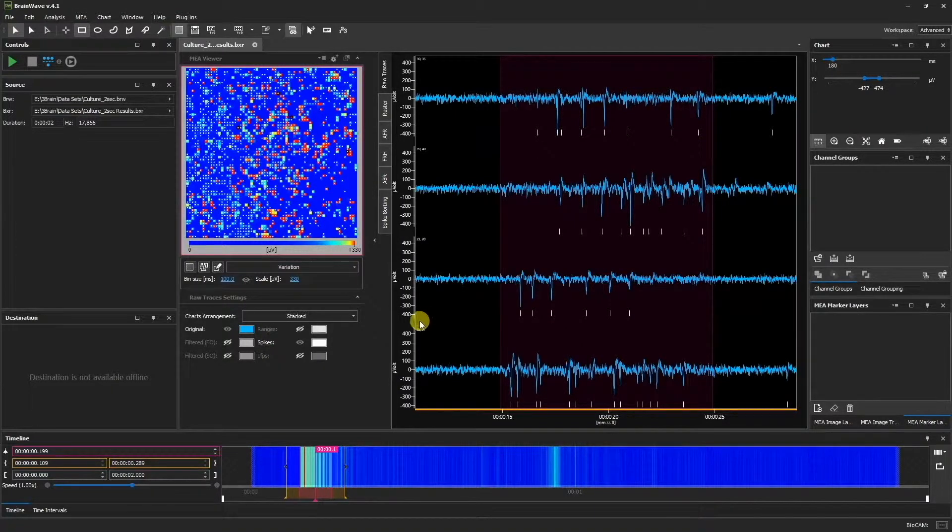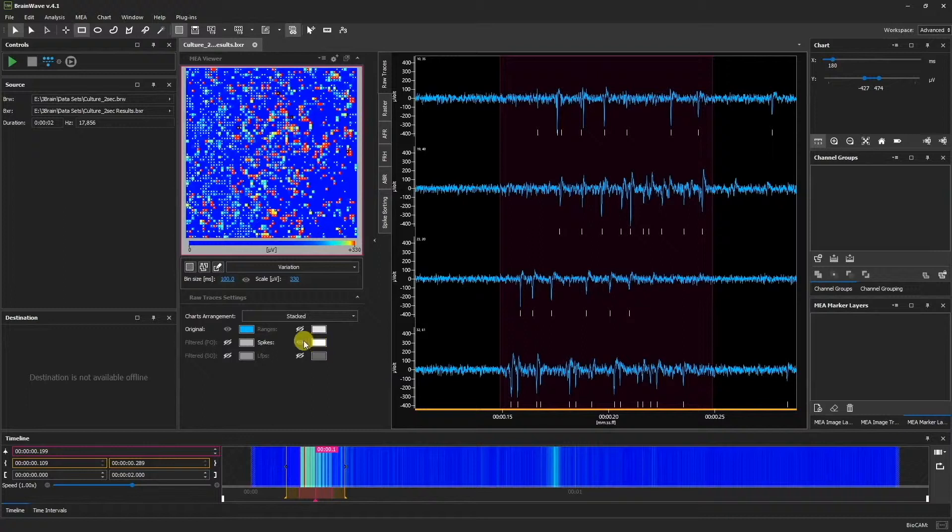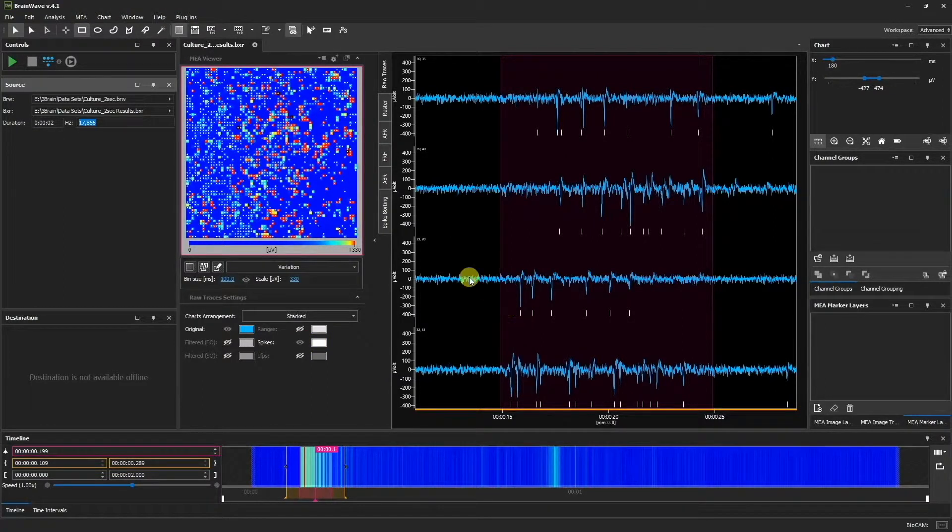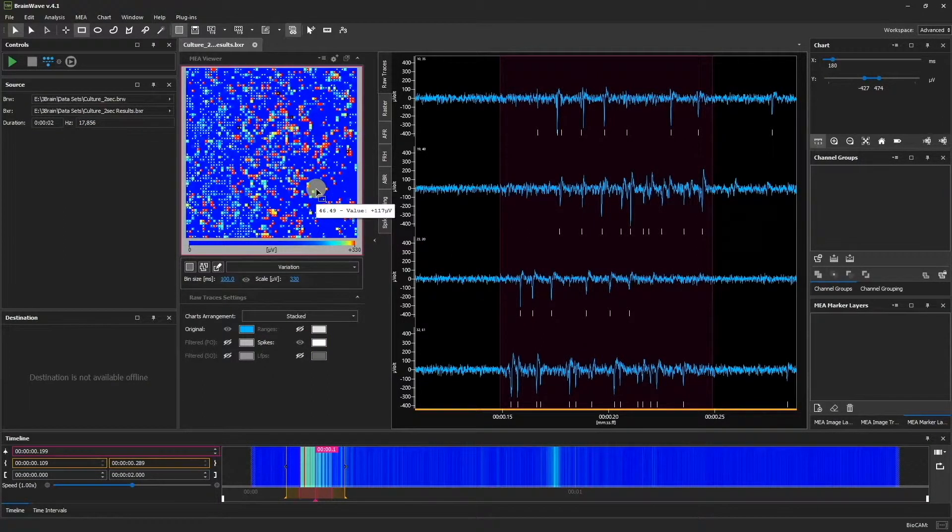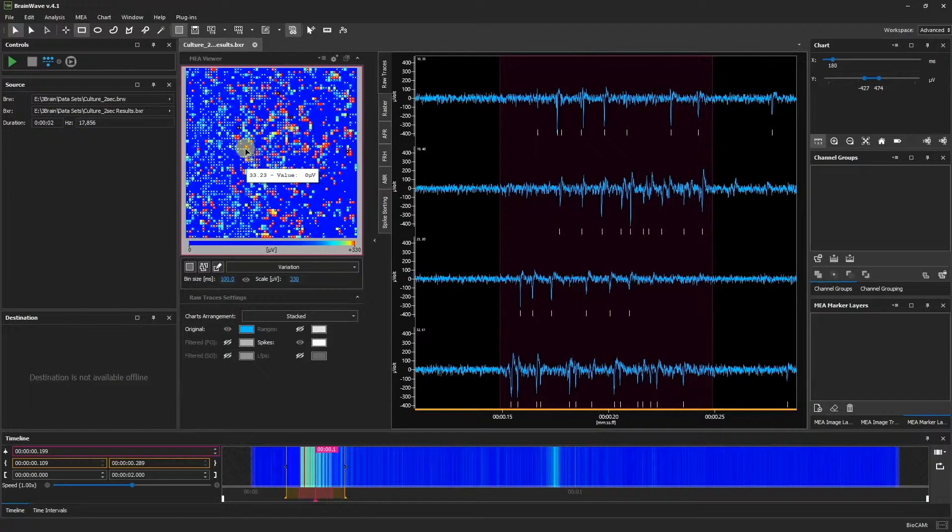If you go to the Raw Traces settings and click the eye next to Spikes, we can also see the spikes in the MEA Viewer color map. Each spike is represented by a white pixel.